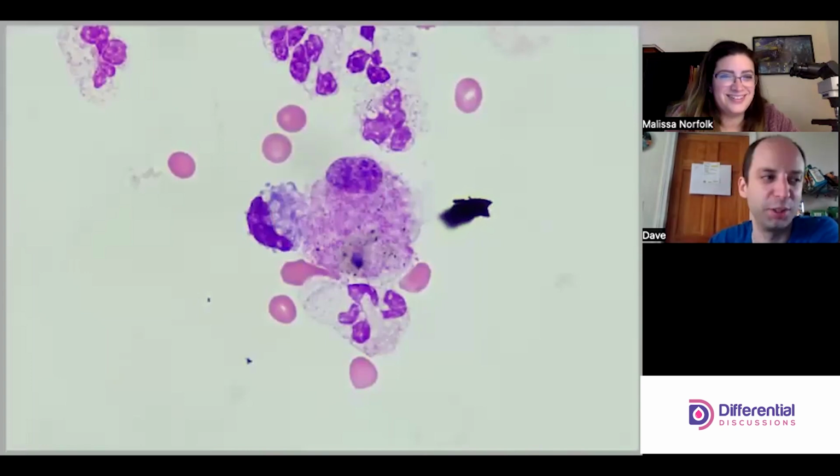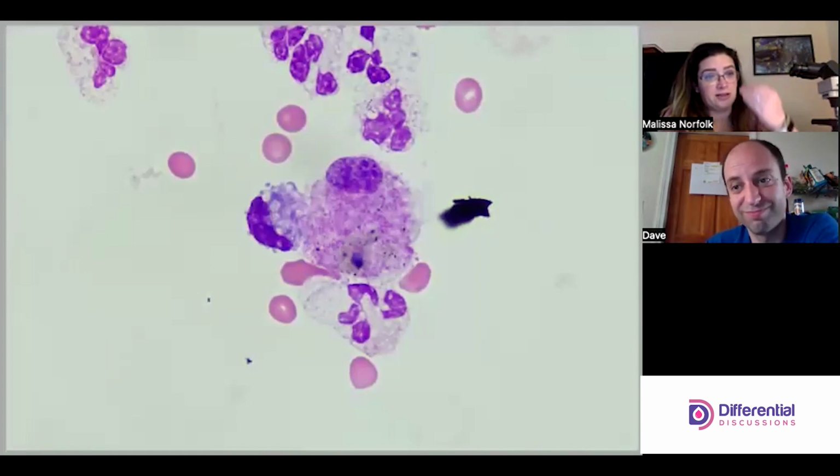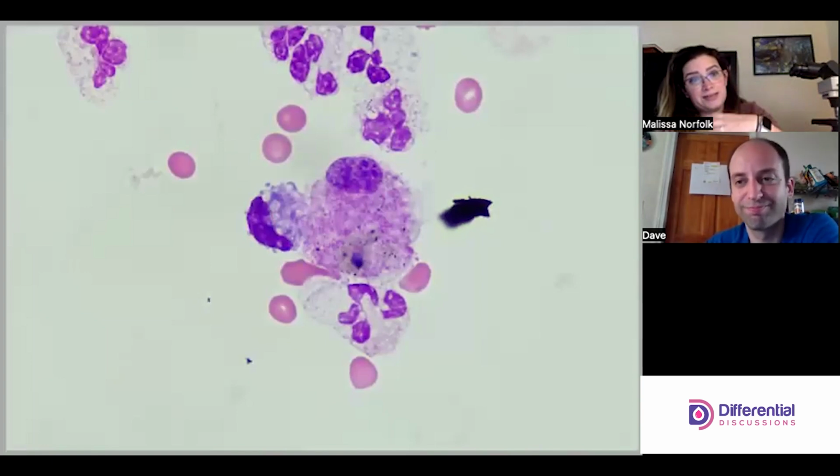Absolutely. This guy here almost looks like there's bacteria. It does kind of look like there's something in there, right? But it's hard to tell. And bacteria wouldn't be out of the ordinary with a BAL either. Typically it's contamination from the throat, because you're sticking the scope down someone's throat and then into the space. Ideally you wouldn't have contamination.